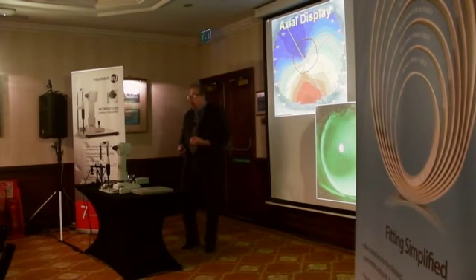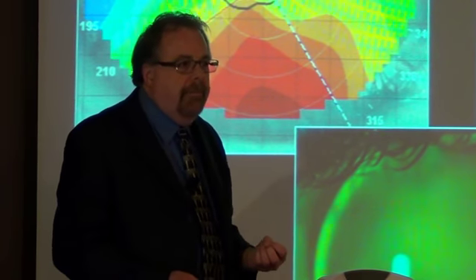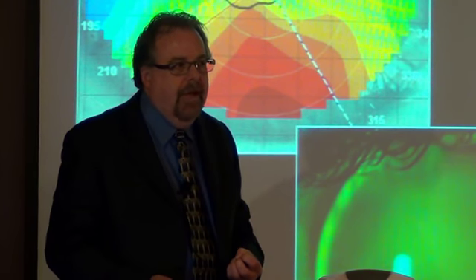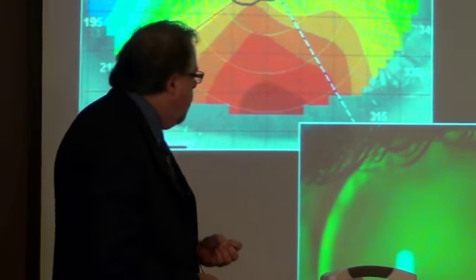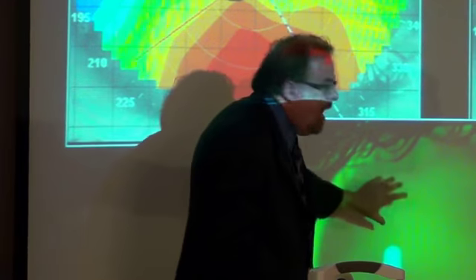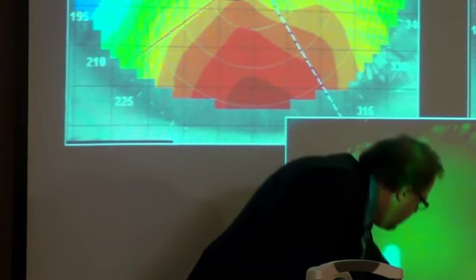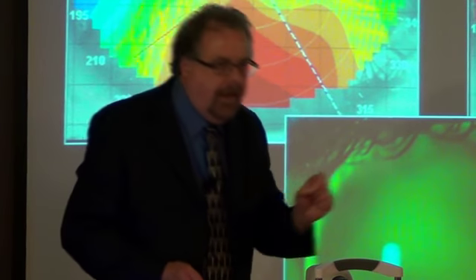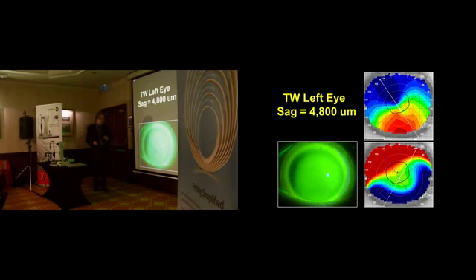Now we're all aware of the fact that there are quadrant-specific lens designs out there, but my experience with the quadrant-specific lenses has been very, very poor. And therefore, when we see this kind of asymmetry, high here, very low here, that's when we begin to entertain the idea of a scleral contact lens.